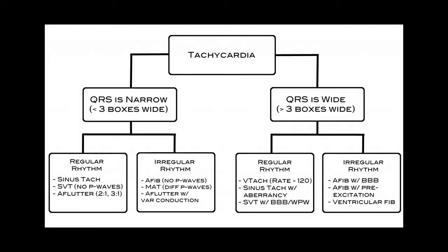So this is a really nice table, and if you have a look at it, your tachycardia is divided into whether your tachycardia is narrow or wide, and whether your rhythm is regular or irregular. And each of these has three differential diagnoses. Right, so we are in this category now today.